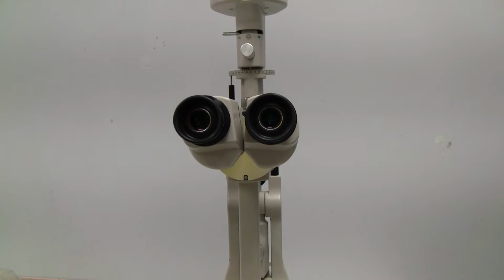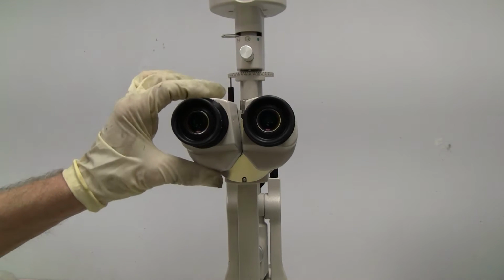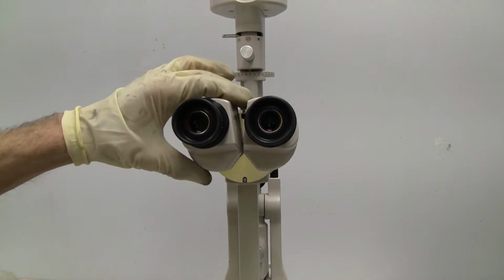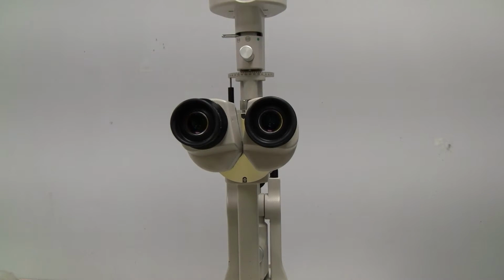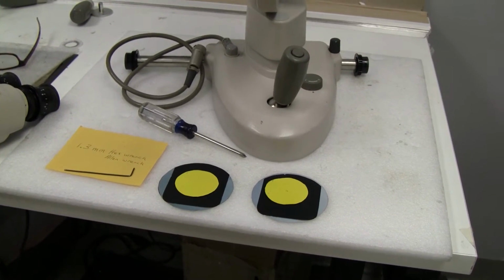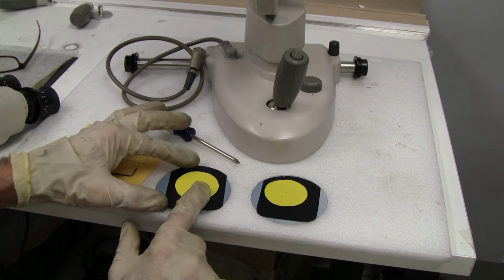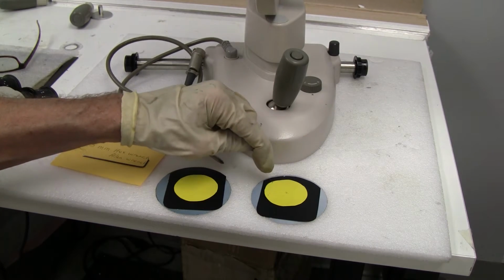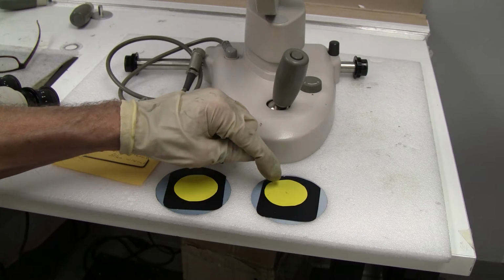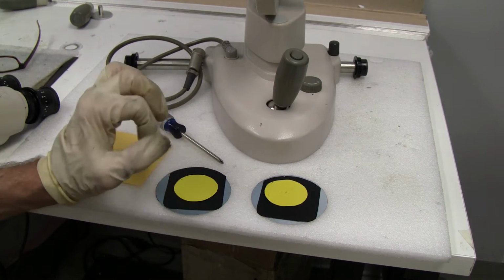If your Marco Ultra slit lamp binocular head, if one of the eyes is out of alignment, in other words, when you're looking through your viewfinder, one eye is centered and the other eye is not centered. Well, we want to try to get this eye to match this eye.